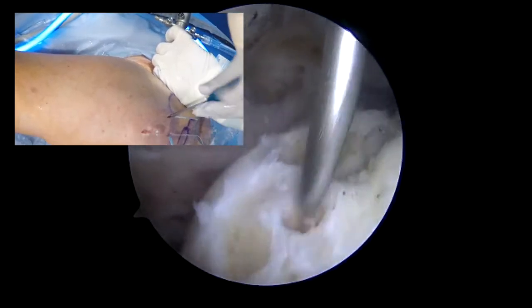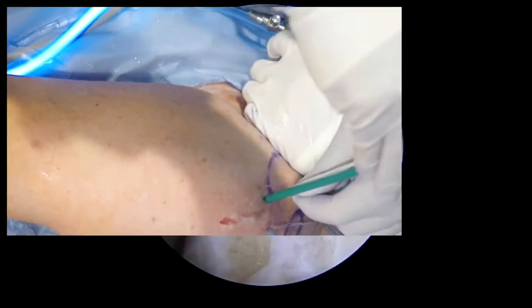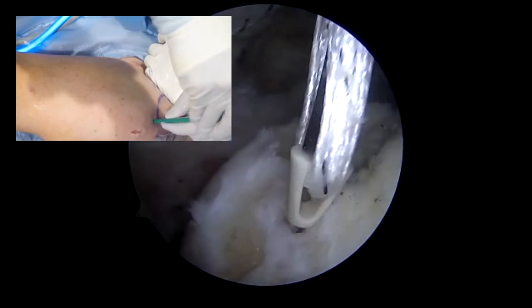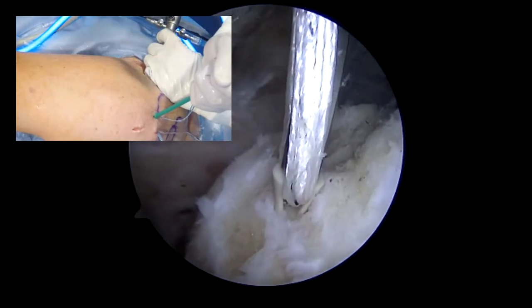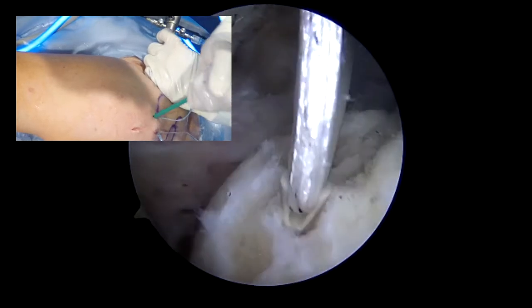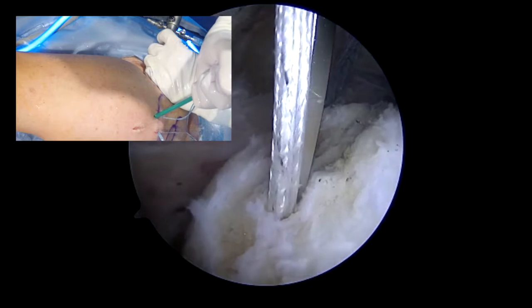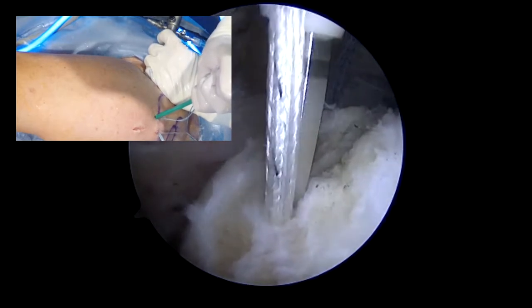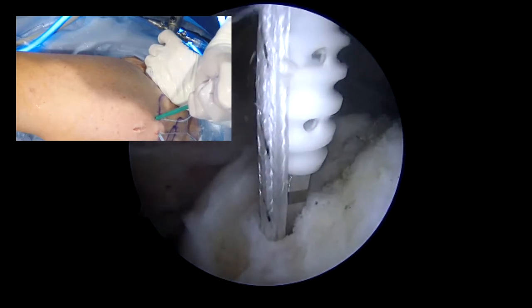This is a 4.75 anchor using fiber tapes. That type of suture will have more strength so that it doesn't pull through the tissue. It's important to ensure that you are tapping down the anchor in the same trajectory as your initial tap.